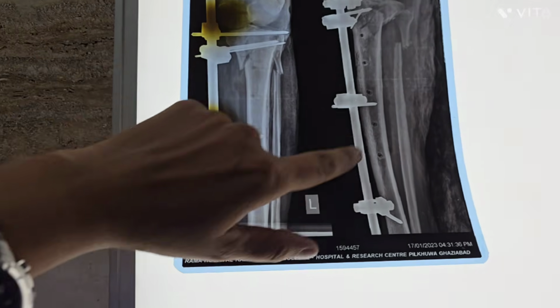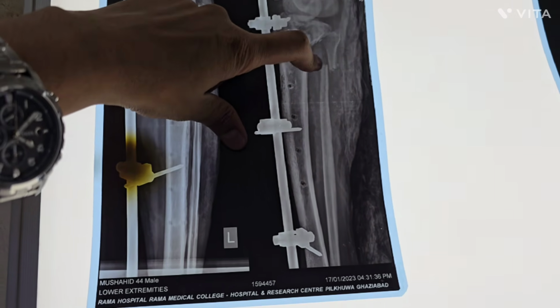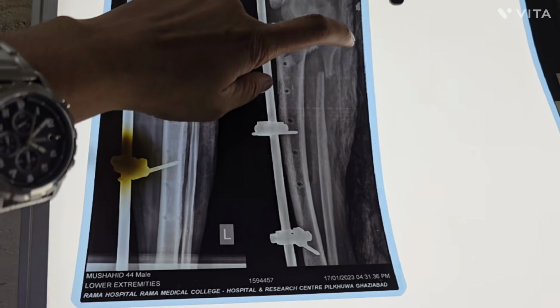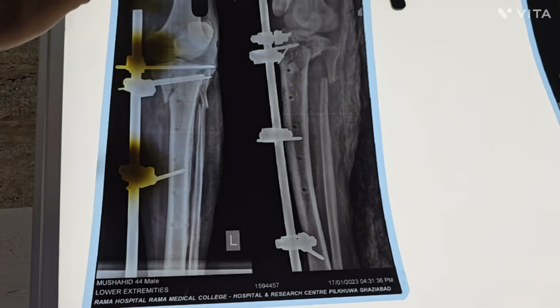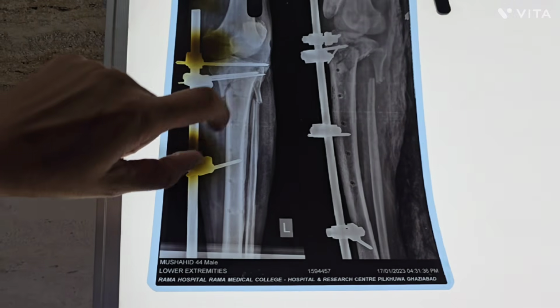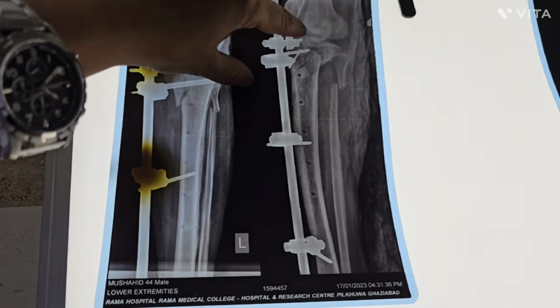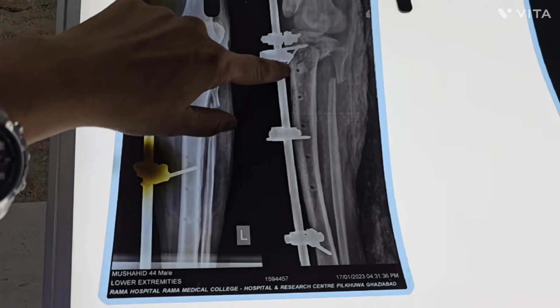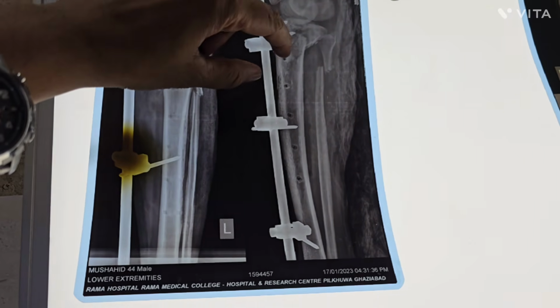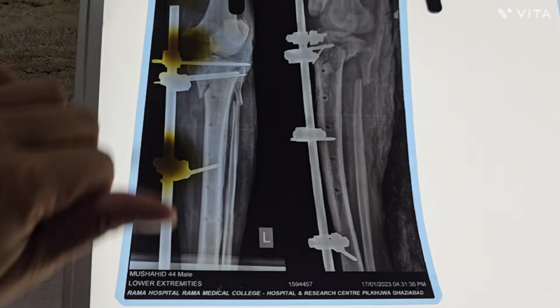In this case, the most common question asked is what are the complications of a fibula fracture at the neck of the fibula: common peroneal nerve injury. These small sinuses mean that somebody previously applied a plate, and these impressions are from the screws of the plate. So that's it.